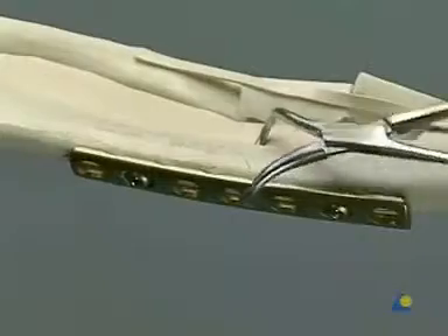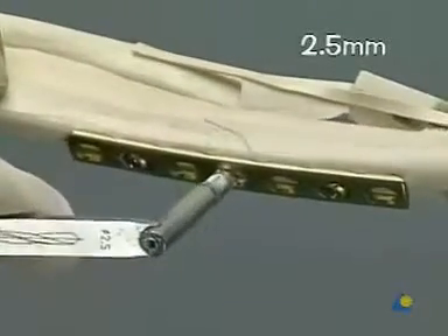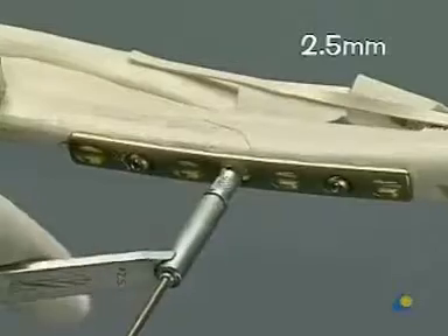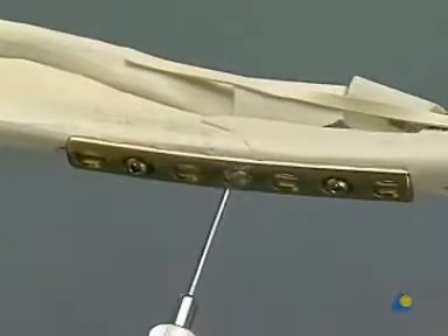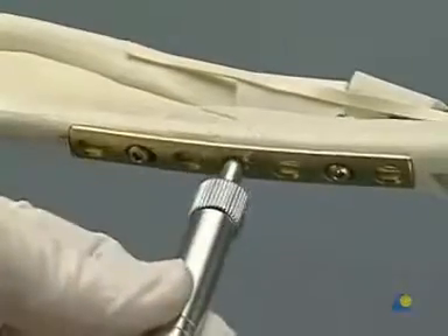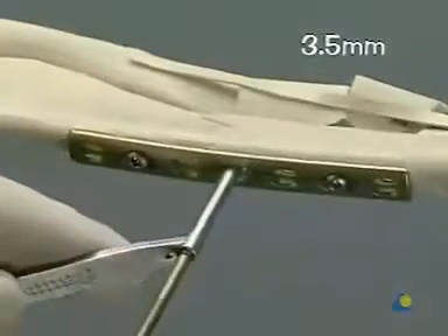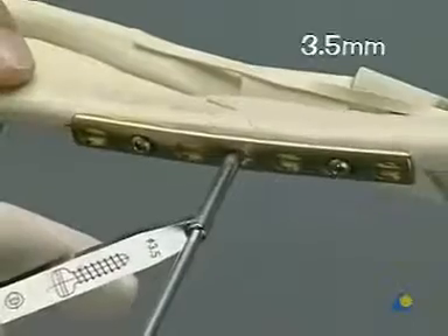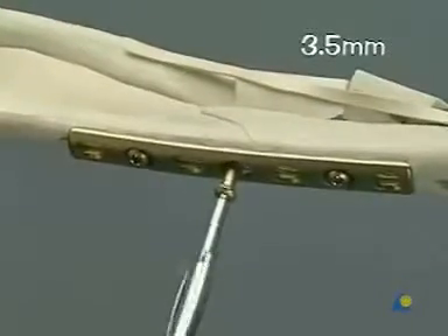The reduction forceps can be removed. We now use the universal drill guide to position the lag screw through the plate. A central 2.5 mm drill hole through both cortices is made and tapped. A 3.5 mm hole is then drilled in the proximal cortex only. Note some residual movement at the fracture site. As the lag screw — in this case a shaft screw — is inserted, the fracture site closes up to display absolute stability.